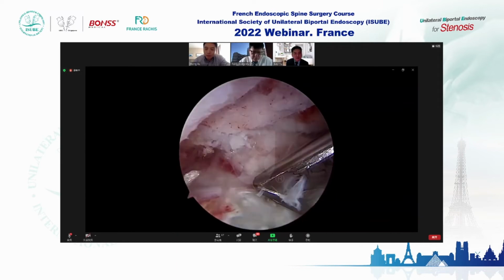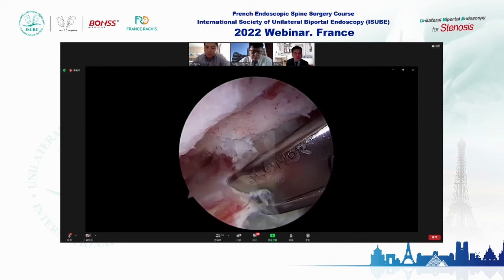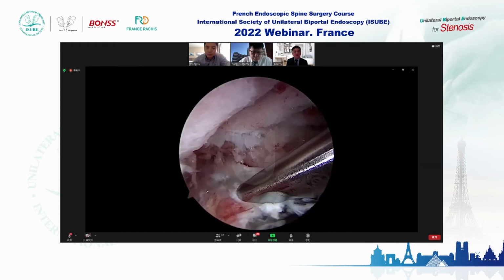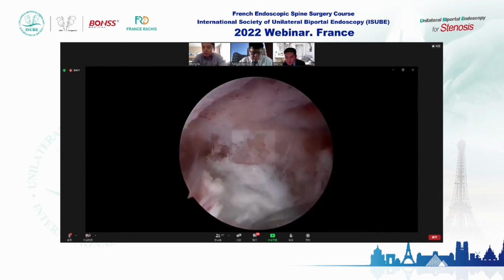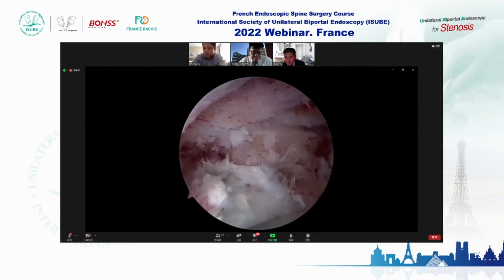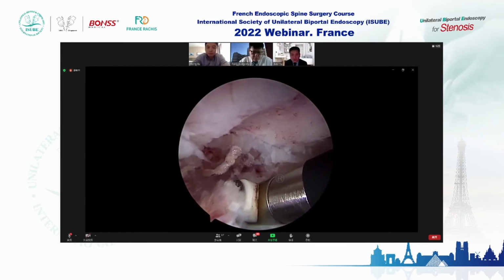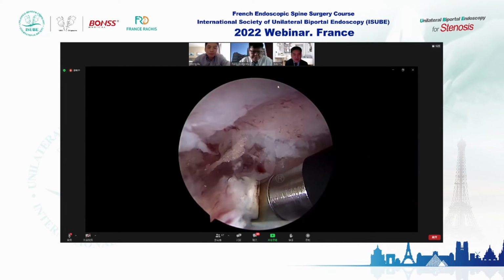Yeah, I will probe this area and open the membrane. I want to see if there is another fragment. I think I will finish the procedure. Yeah. There is nothing there in this area. Maybe I have removed the disc fragment totally. Okay. Okay, thank you everyone. I will finish the operation. Okay. Great job. Thank you, thank you.